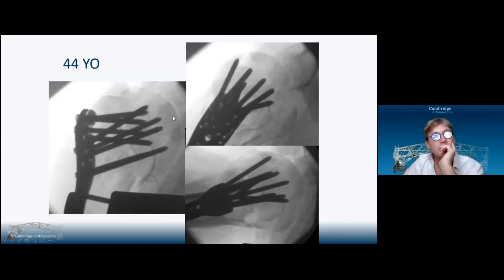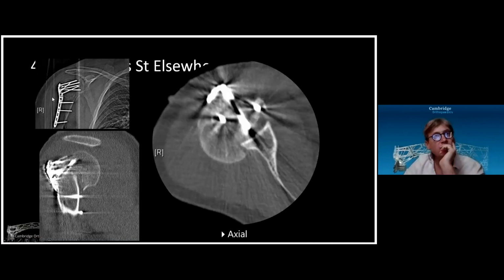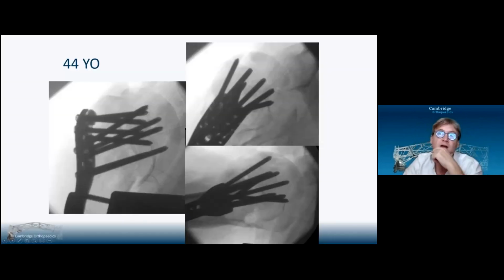Extended anterolateral, took out the screws, which were loose in the bone, then used a ring handle spike percutaneously from the back to disengage the head from the glenoid, put a finger around the back and pushed it round, and managed to reduce the head fragment into the glenoid. It's not perfect. It's still angled slightly posteriorly, but it's back in joint.